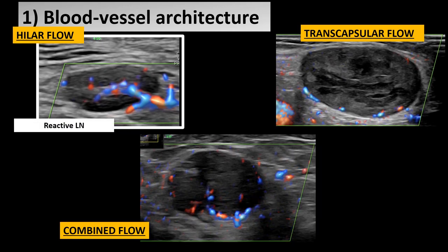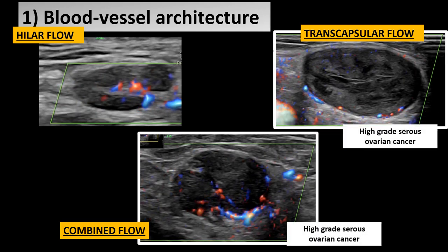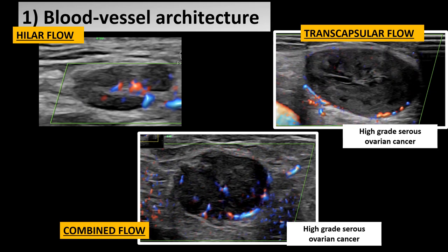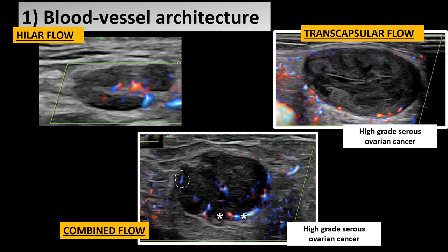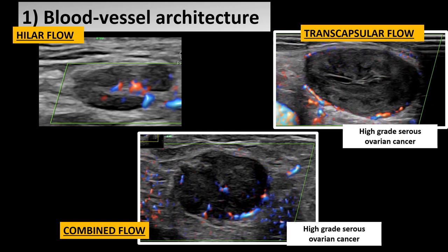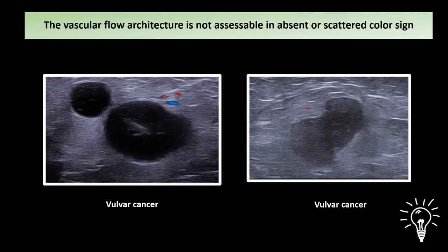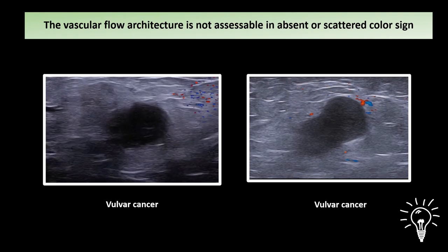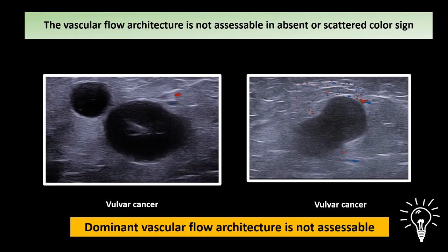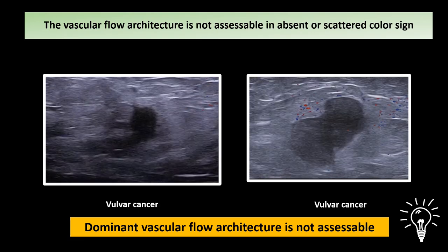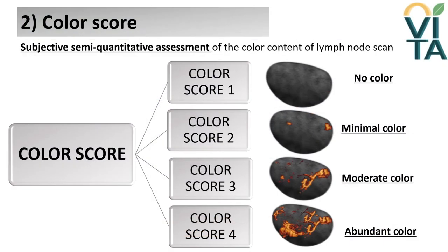The lymph node with only hilar flow is completely benign, while the presence of transcapsular vascularization in transcapsular or combined dominant architecture is explained by neoangiogenesis and neovascularization due to metastatic infiltration — demonstrated in two cases of high-grade serous ovarian cancer. In two metastatic lymph nodes from vulvar cancer, vessels are not visible in their entirety and their origin cannot be determined, so the vascular dominant architecture is not assessable. The color score is a subjective semi-quantitative assessment of the color content of the lymph node seen on color or power Doppler ultrasound.